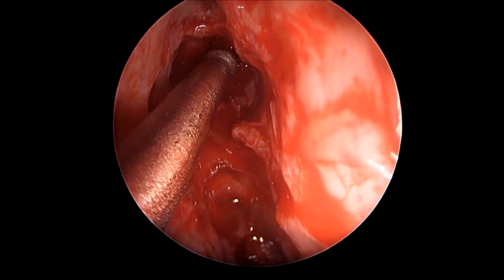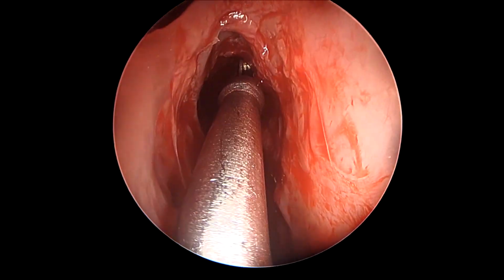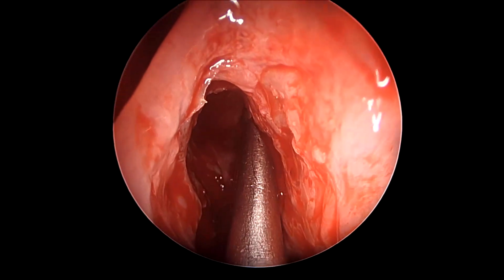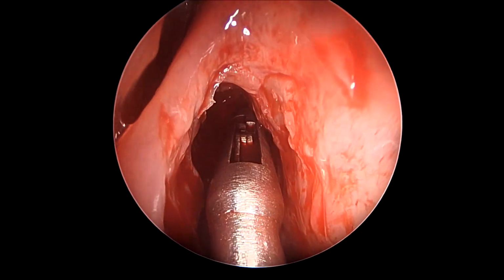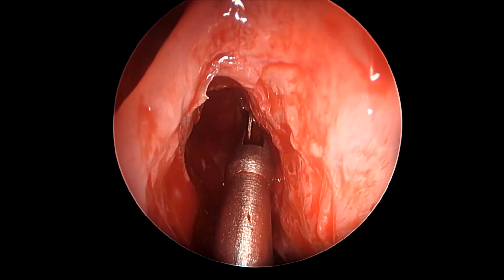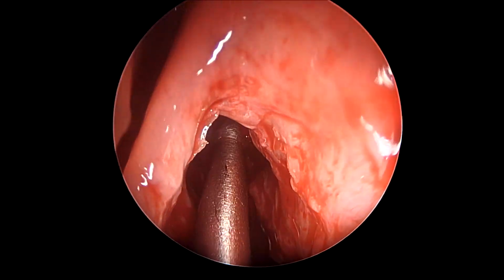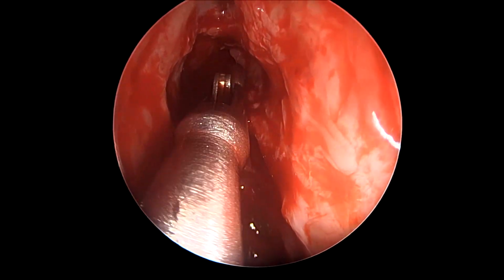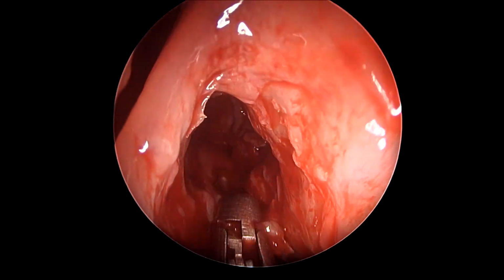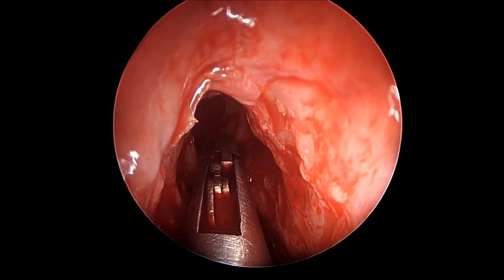We can still make a small attempt to see if we can clear the superiormost part of the party wall that separates the bulla cell from the frontal sinus. One must be careful not to overshoot or remove the mucosa from the frontal sinus, or demucosalize it, because that would lead to scarring. But a little bit of bone, if it can be removed, would just open the frontal sinus completely, thus reducing the chances of recurrence of polyp formation in these kinds of patients.